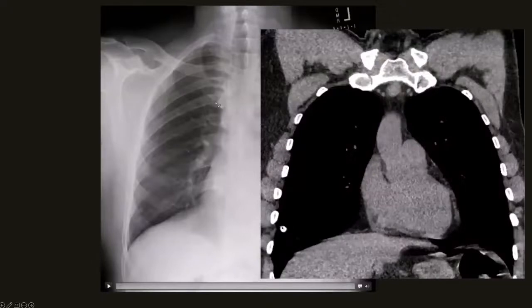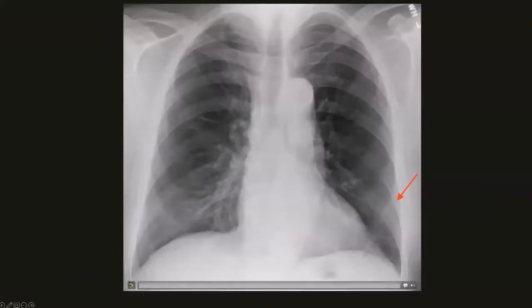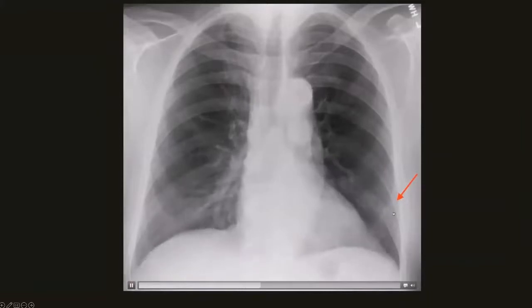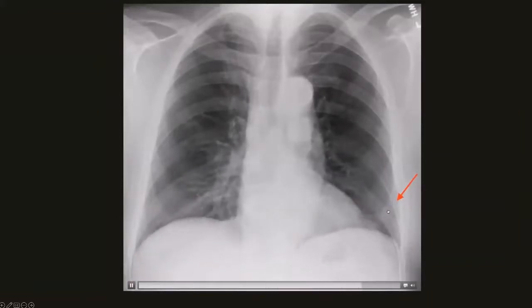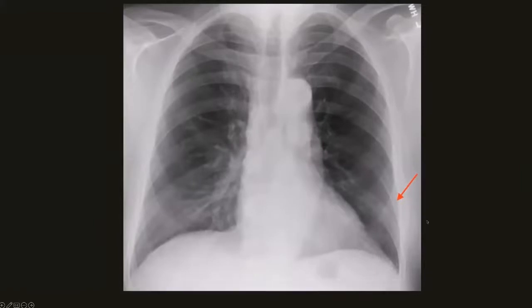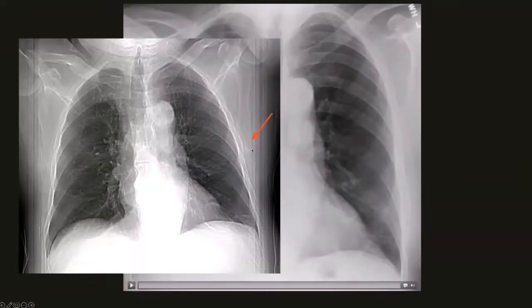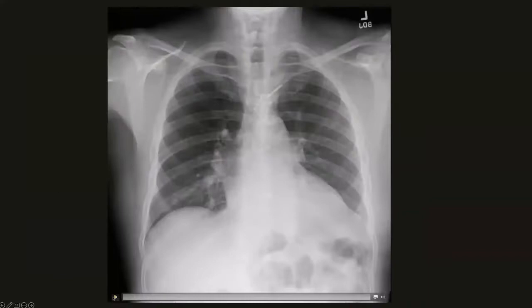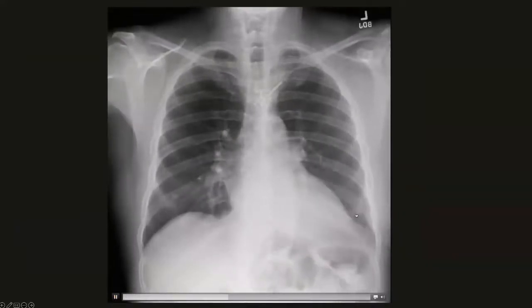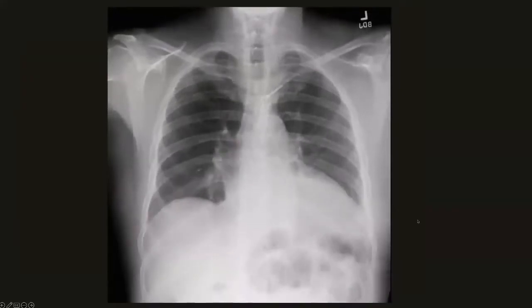This was subsequently confirmed with CT, which showed a calcified nodule in the right lower lobe. As a corresponding case, a chest wall nodule was identified where the lung parenchyma moves up and down while the nodular opacity at the left lung base remained fixed relative to the chest wall — suggesting a chest wall lesion, confirmed to be a nipple shadow. A subsequent CT for a different indication confirmed the nodular opacity was indeed a nipple shadow, as it moved more laterally when the patient lifted their arms above their head.